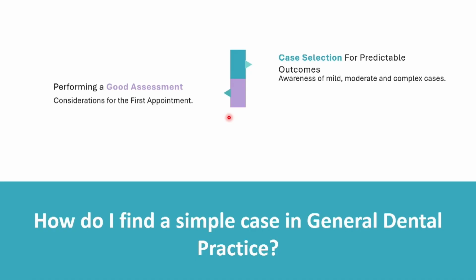The process of selecting a case is made easier if we perform a good assessment. You cannot decide if a case really is mild, moderate, or complex from photographs alone. You have to do a good assessment, and it's the foundation of your case.